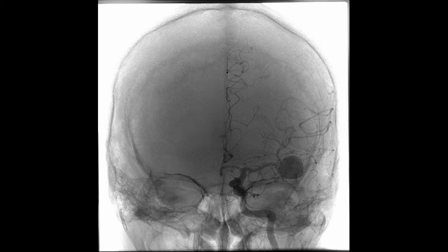the procedure. Typically a catheter is inserted into a large artery, such as the femoral artery, and threaded through the circulatory system to the carotid artery, where a contrast agent is injected. A series of radiographs are taken as the contrast agent spreads through the brain's arterial system, then a second series as it reaches the venous system.